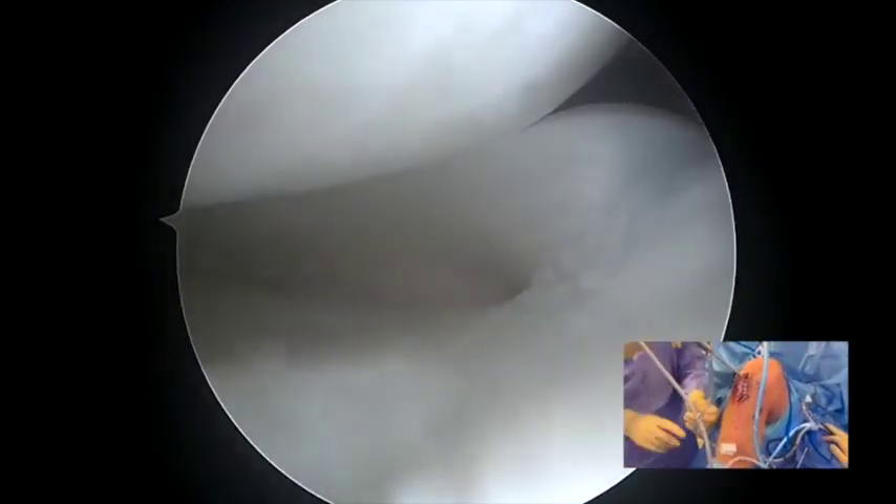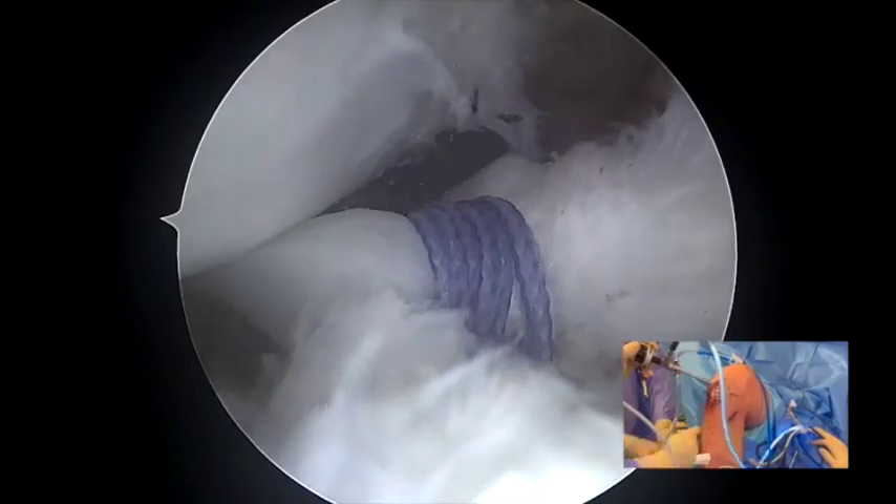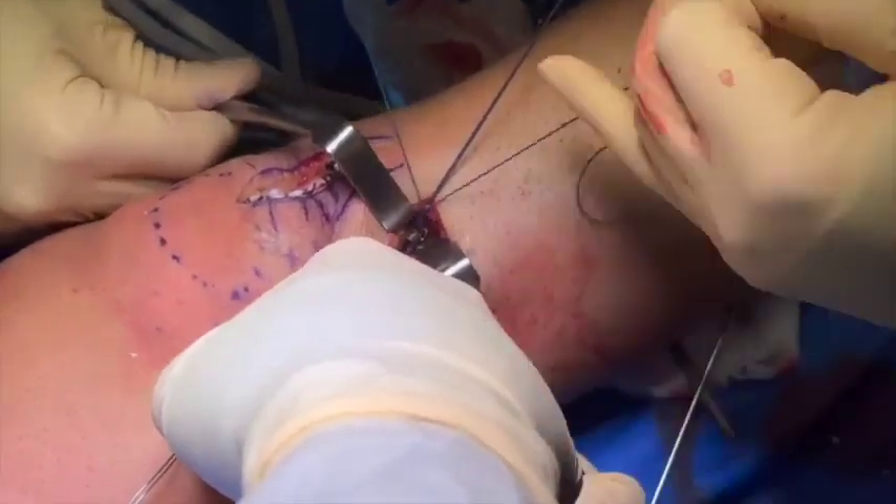Thus, the posterior root is repositioned. Multiple knots are then applied to the suture over a round button of 11mm placed against the lateral tibial cortex.